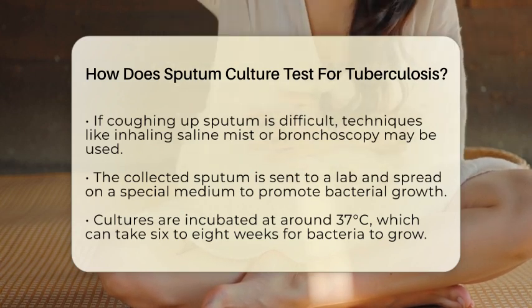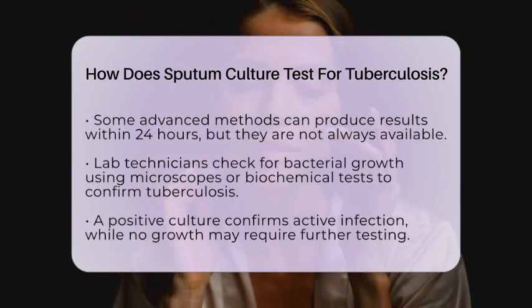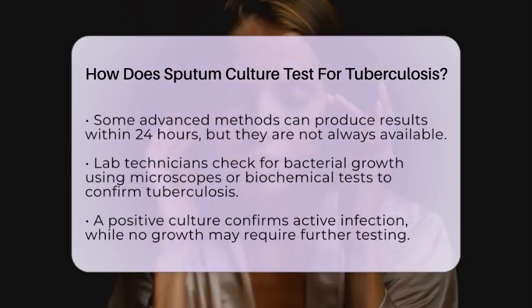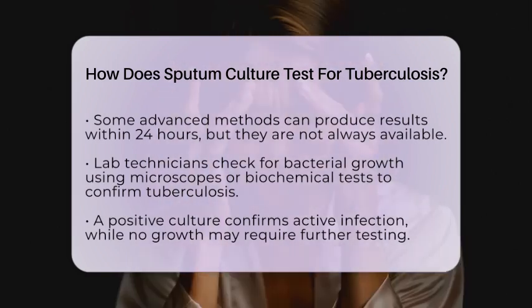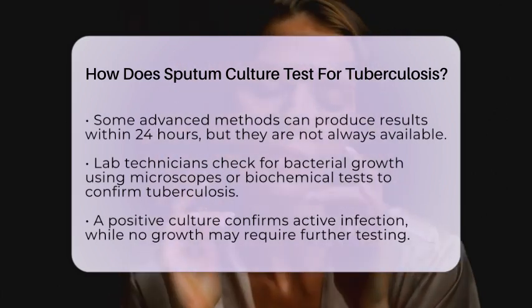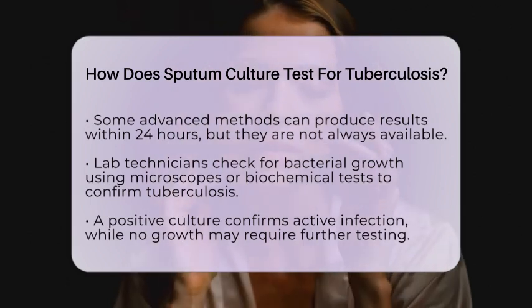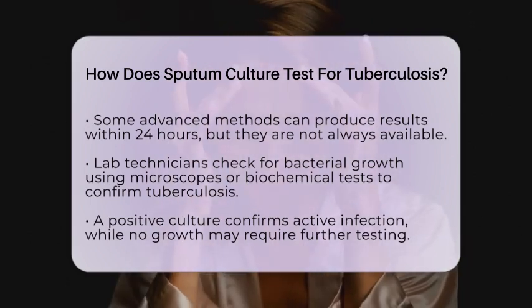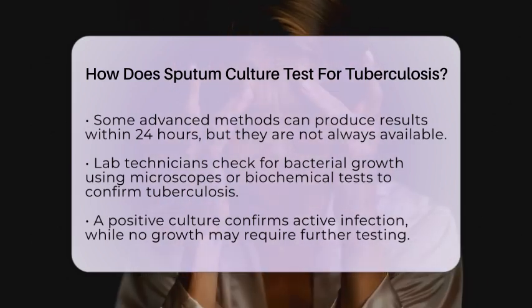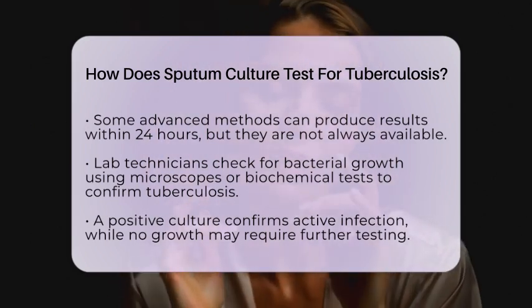Some advanced methods can speed this process and give results within 24 hours, but these are not always available everywhere. During incubation, lab workers regularly check the cultures for signs of bacterial growth. They might use microscopes to look for bacteria directly or perform biochemical tests to confirm that the bacteria are indeed Mycobacterium tuberculosis. If bacteria are found, it confirms an active tuberculosis infection.